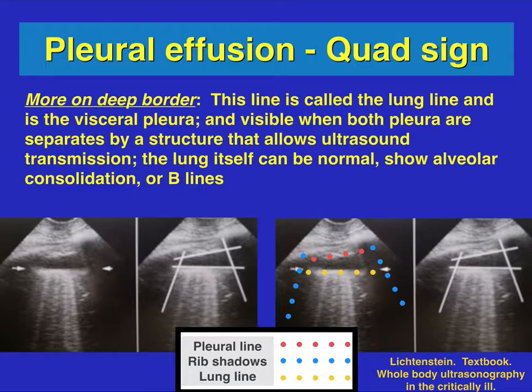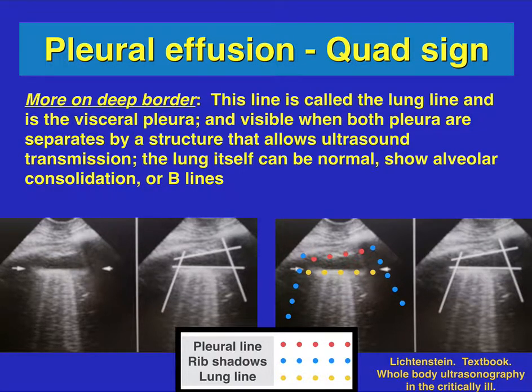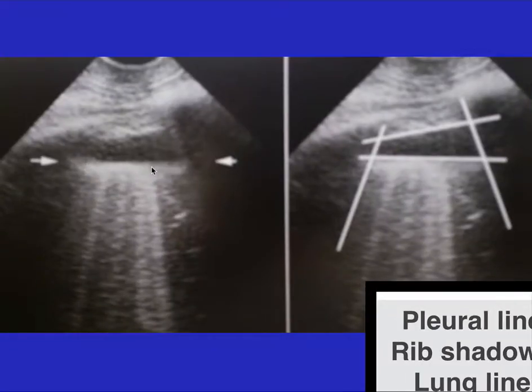On the quad sign, the deep border is called the lung line and represents the visceral pleura. It is usually visible when both pleura are separated by structures that allow ultrasound transmission, such as fluid. The lung itself can be normal, show alveolar consolidation, or even B-lines. In the image shown here, you can see B-lines, the lung, the pleural fluid, and the rib shadows.